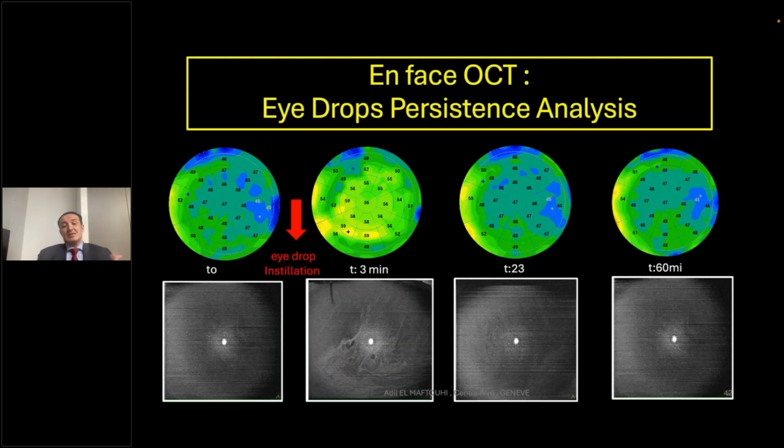And it makes sense that, probably in the future, we can analyze eye drop persistence with epithelium mapping and en-face OCT.